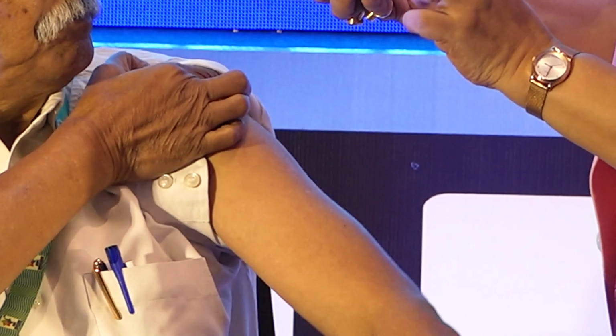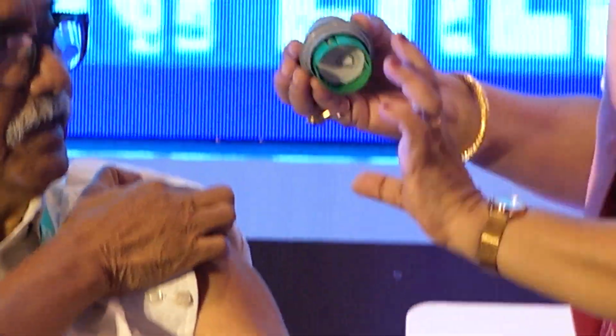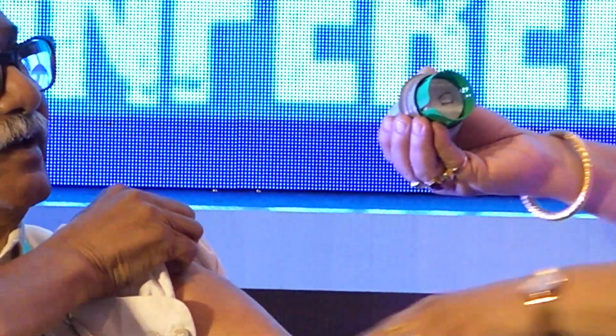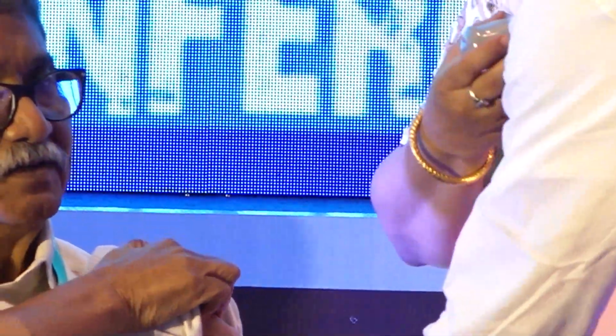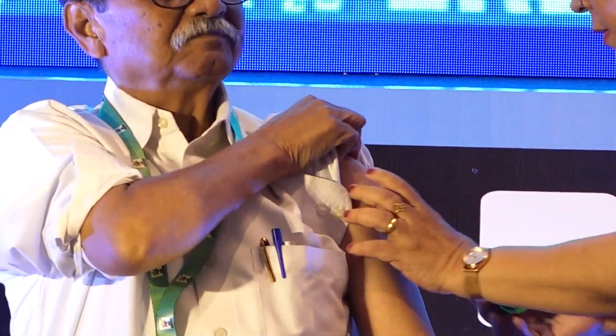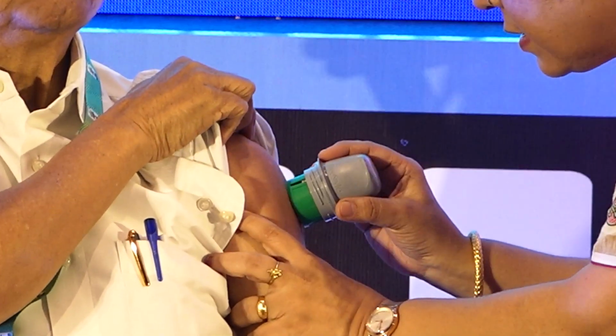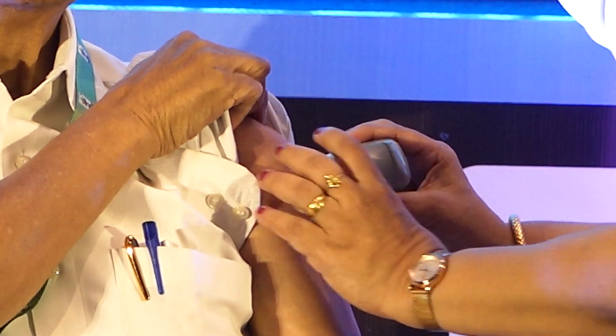Yes, there will be a prick because the needle has a capillary inside. You won't like it. Release it, there is tape, some cello tape or something, it will stay there. So just the lateral aspect of the arm.